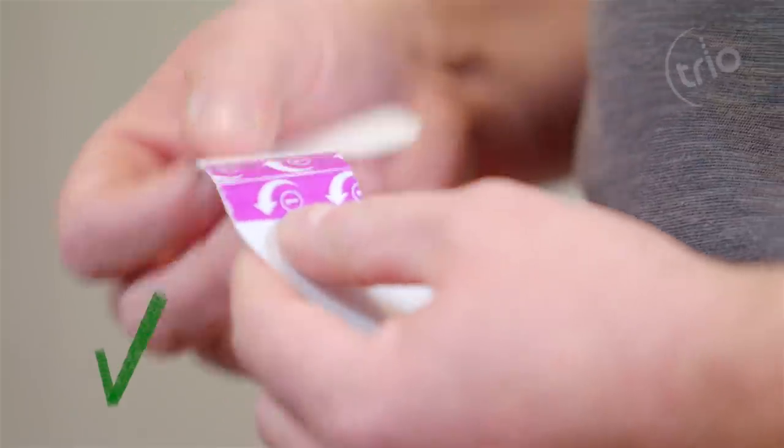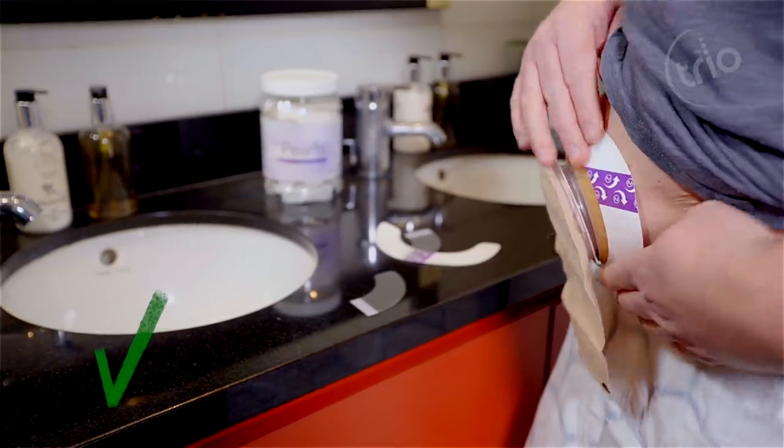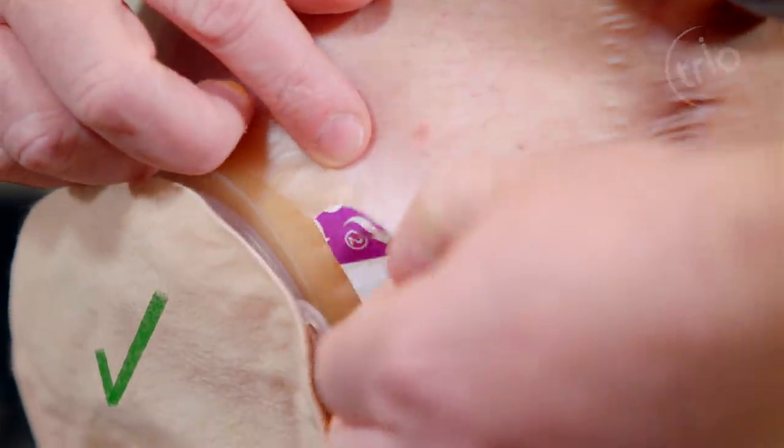Then remove the clear release liner marked one from the Trio Silics Flange Extender and position it where it feels comfortable on your appliance and skin. Once it is securely in place, remove the paper release liner marked two and smooth it down.